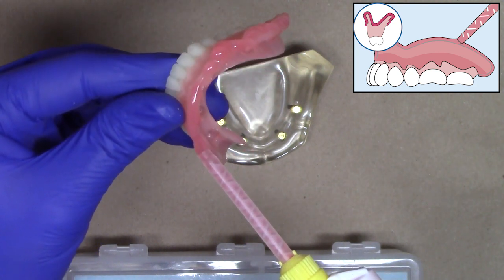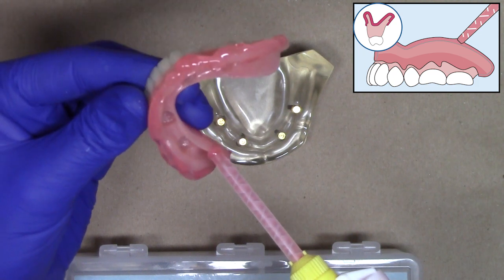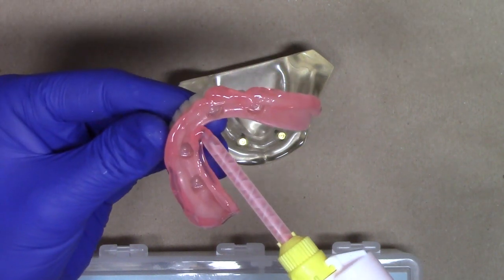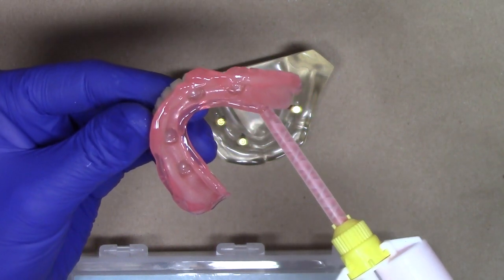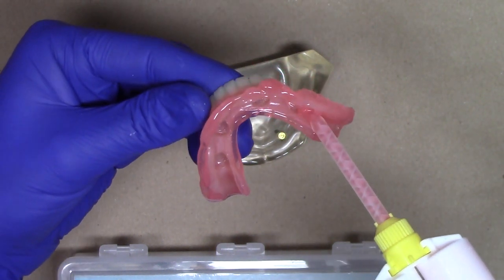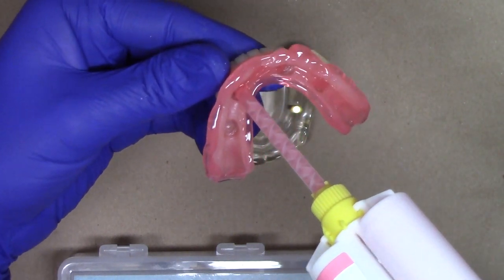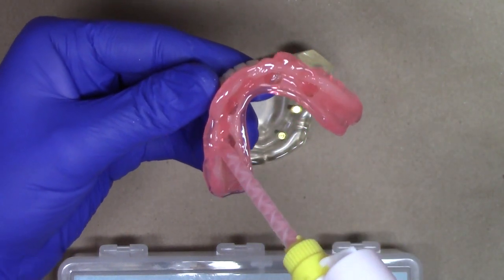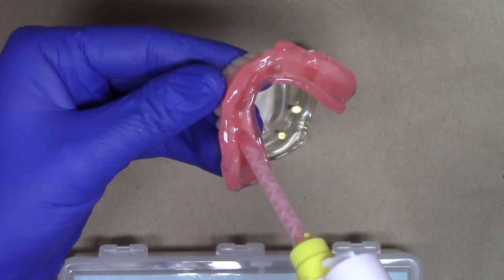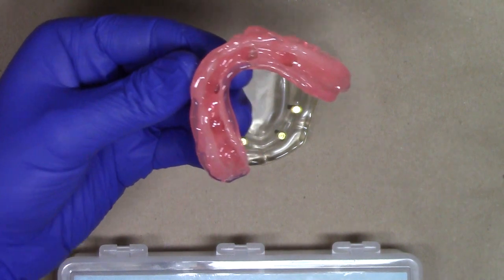And just following it just like you would use border molding material, and on the lingual slope. Just one nice gentle motion coming across into my recesses and the intaglio surfaces. And that's pretty much good to go.